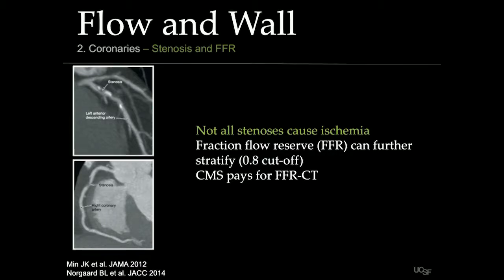And importantly, based on a lot of recent research, this FFR analysis, which can be done non-invasively based on CT data, has passed an important threshold. It's now reimbursed by Medicare in the United States. And as a quick aside, maybe MRI can get back in this game. We heard earlier that perfusion imaging with MRI performs with similar diagnostic performance to FFR.